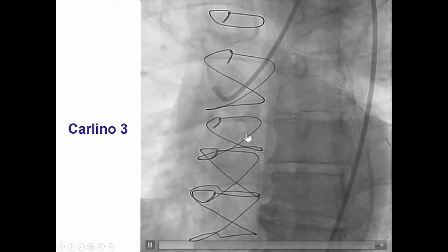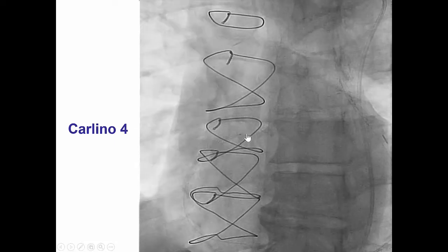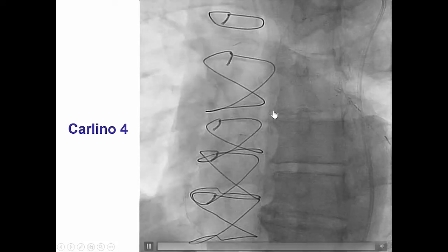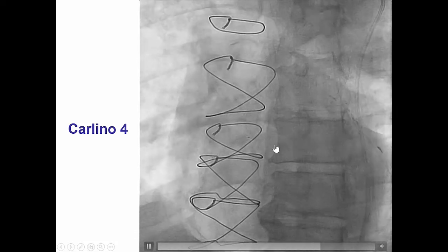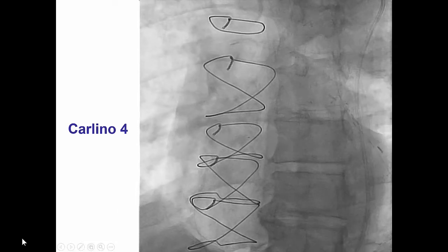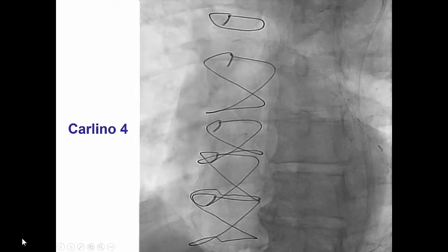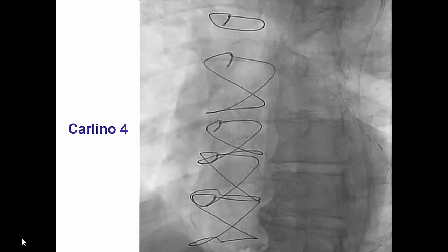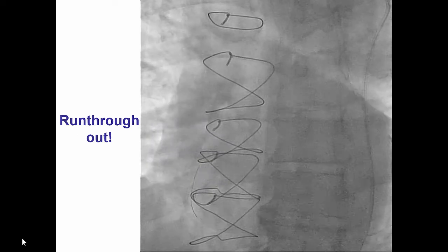Finally, with the fourth Carlino injection, we are now seeing contrast flow into the aorta. This is an example of sequential use of the Carlino technique alternating with various Gaia guidewires until we are able to get all the way into the aorta. We were then able to advance a run-through wire all the way out into the aorta.